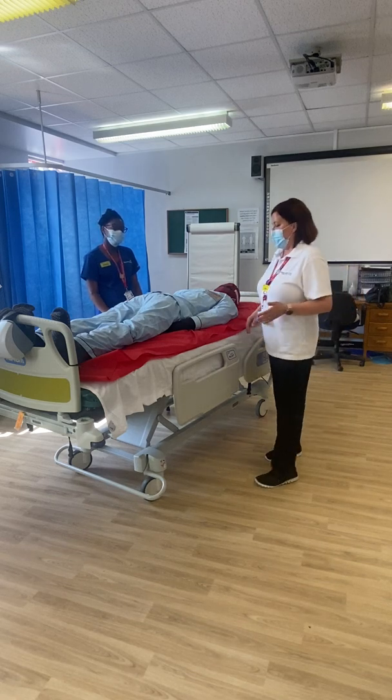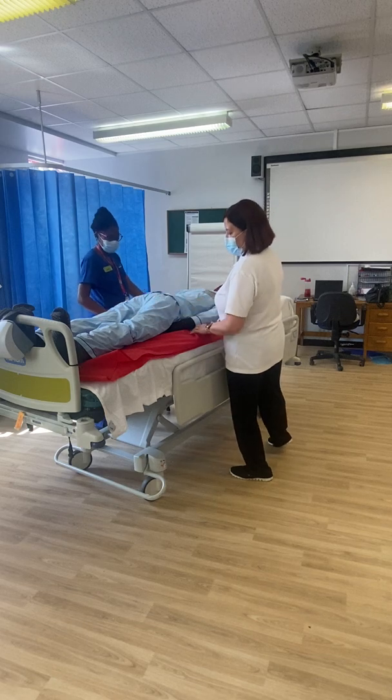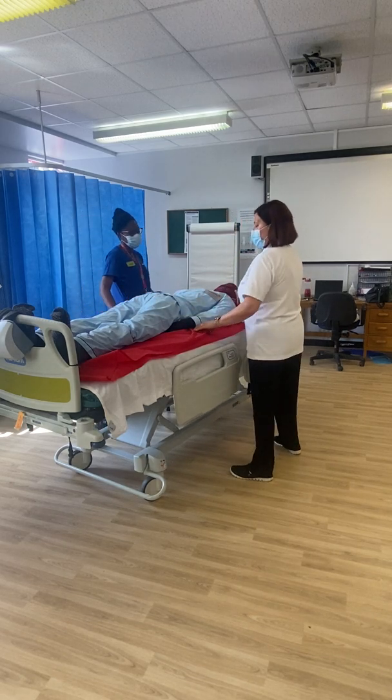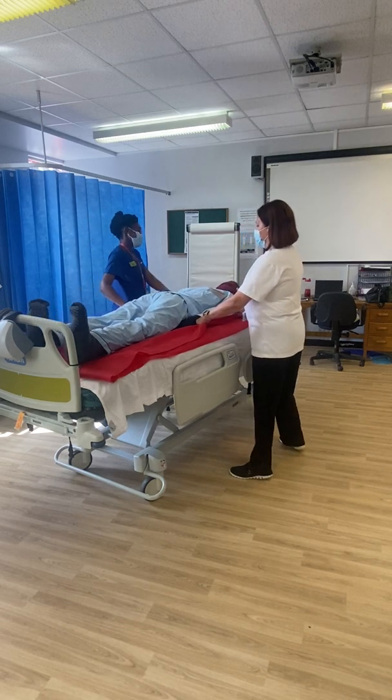themselves. So to come back up the bed, this time we'll have our weight on the feet and leg, and the manoeuvre will be a weight transfer towards the top of the bed. Ready, steady, slide.